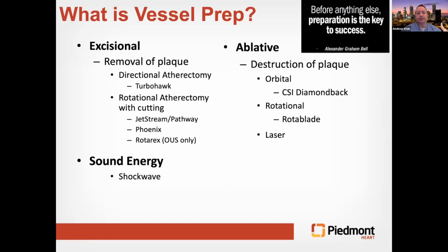So we've seen the basic science, and I'm going to dip into where we're at currently with the data out there for vessel prep, specifically for drug delivery, because I think atherectomy itself, though not to be used in every case, does have applications in certain environments. And hopefully when it comes to vessel prep, specifically for barriers for drug delivery, we can talk a little bit more intelligently about why one might use it.